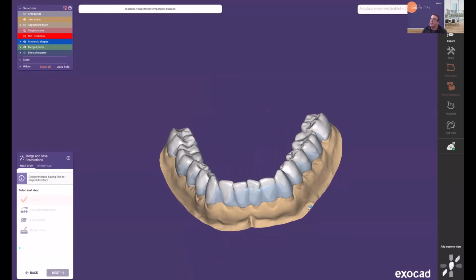Well, while that's waiting, let's check in with Dan, see what we're doing on the question side. Yeah, so we've had some questions pop through. One of the questions was if this software version's available currently, and it is. You'll just need to contact your reseller to request to have your installation upgraded. So that was one of them. We had some questions about the paint and pull feature, about the bar profile, which I answered. But other than that, and then bite splint attachments, there were some questions revolving around those.